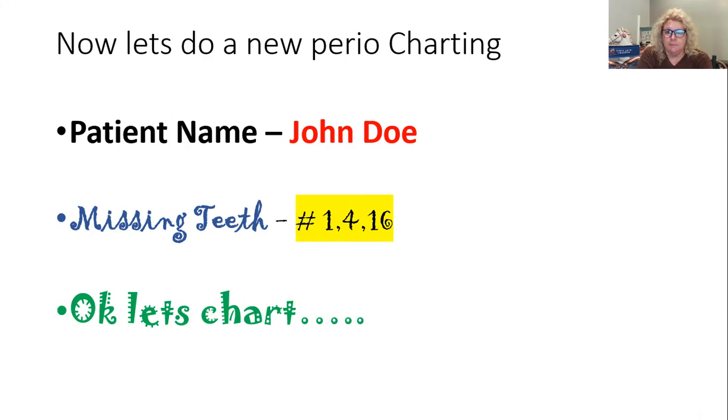Where am I? Everybody should have said mesial buccal of number 11. 2, 2, 3, 3, 2, 3, 3, 3, 3, 3. Where am I?